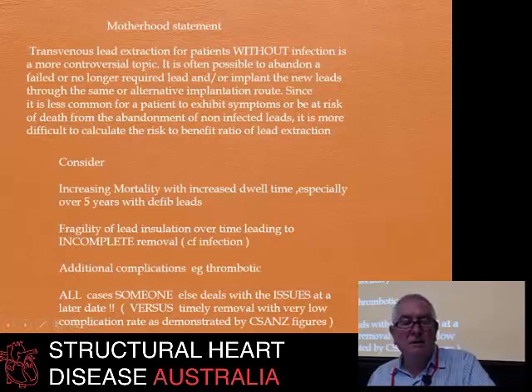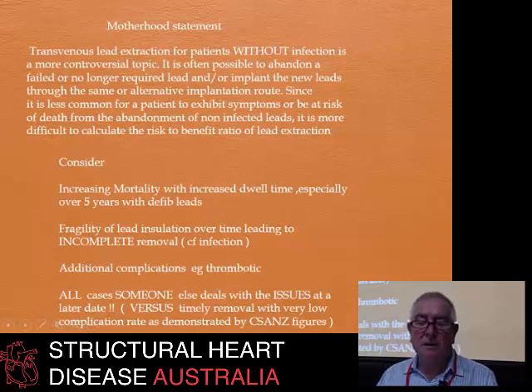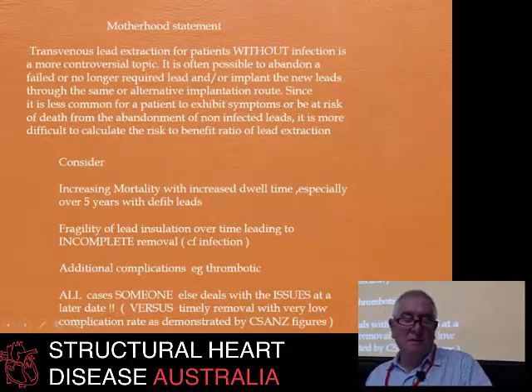And what they say here is that it's less common for patients to get symptomatic if you abandon the leads than if you extract them. That may be right in some centres around the world, but what it doesn't consider is that the longer you leave those leads in there, the greater the risk if you have to take them out, particularly defib leads, and that risk starts going up after about 5 years.